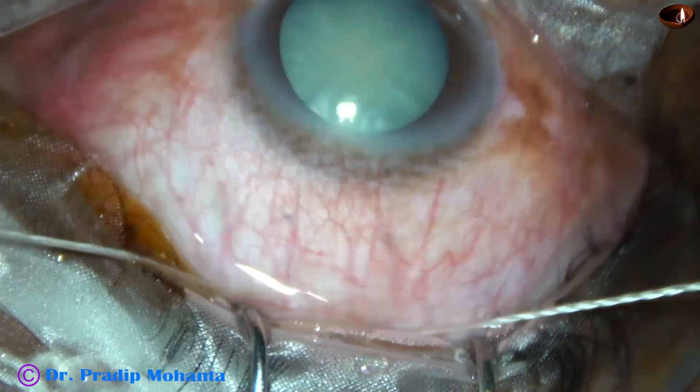I am going to the proper depth, about half thickness of the sclera, and I am going to that depth from one end to the other end. Equal depth is required to get the proper plane of dissection.